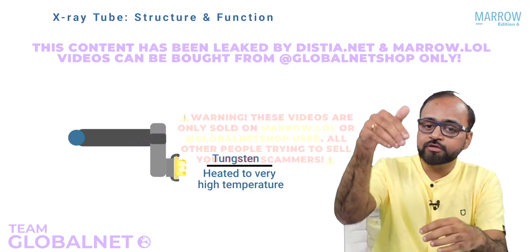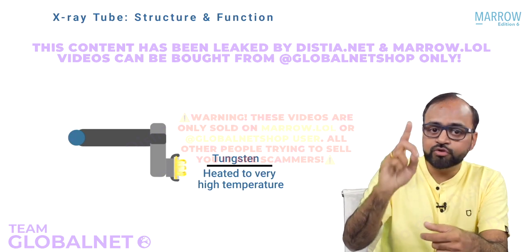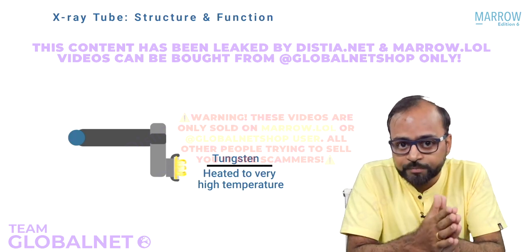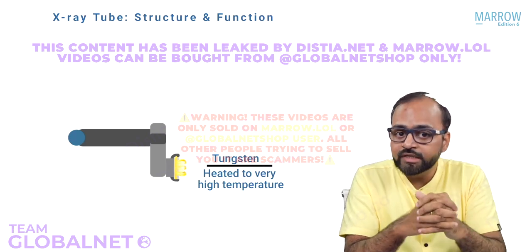What happens to those immersion water heaters that we use? What is there inside it? There is a high resistance coil. When you switch it on, you put it in water, the water is going to get heated. Heat is produced when you pass electric current through a high resistance wire. Same thing is happening here. So the tungsten filament is going to get heated.